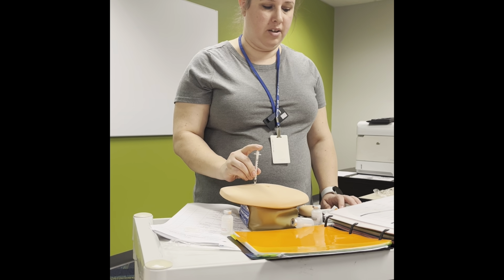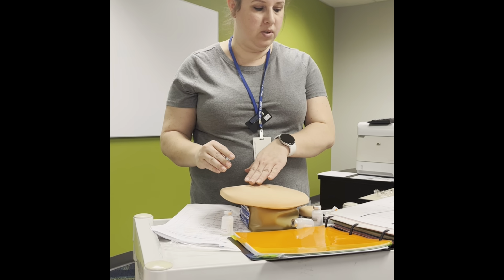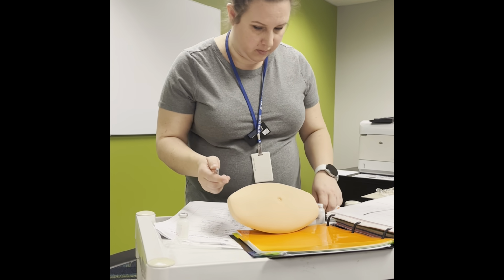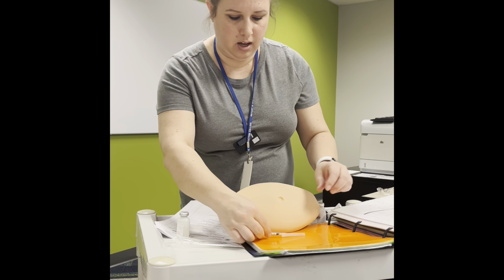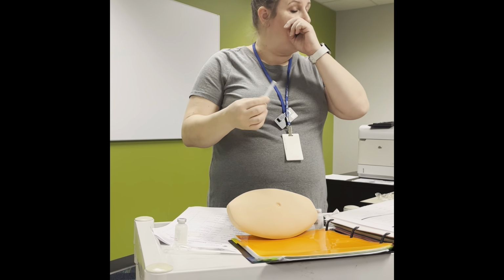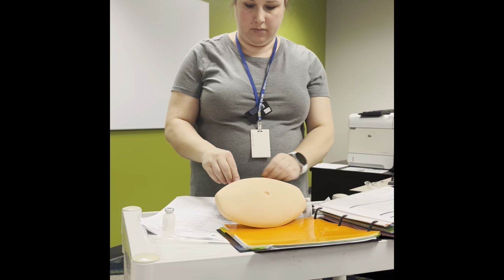Again, we're gonna inject slowly. We're gonna pull it right back out. This time, if there's some oozing, we could touch it. We're going to cap this, wherever my cap went. We're going to cap it, put it in the sharps. Then again, put our patient in a comfortable position, do hand hygiene, leave. So you can do the other.